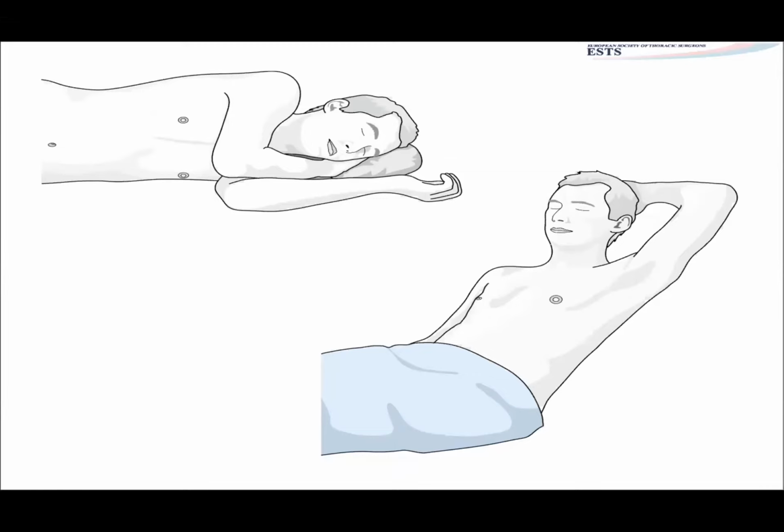Okay, so this is the usual or the common position, which is the semi-sitting position that we are using. We are keeping the patients in it just to put the chest tube. Okay, and the other position is the lateral decubitus, which we usually use in case of thoracotomies intraoperatively. What I want to say, in thoracotomies, video-assisted thoracoscopic surgery. Okay, but this is the commonest position we usually do. Okay, so you have to prep and drape the patient very well after giving the systemic analgesia.